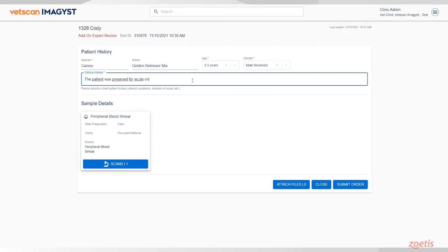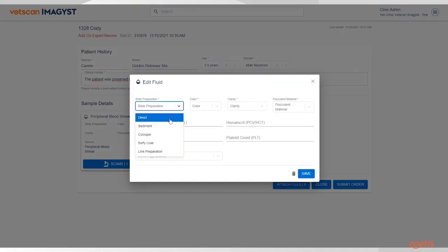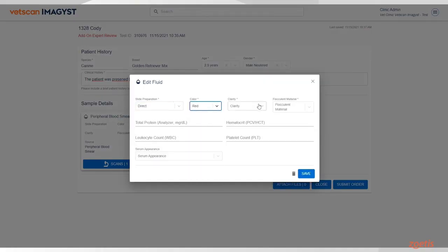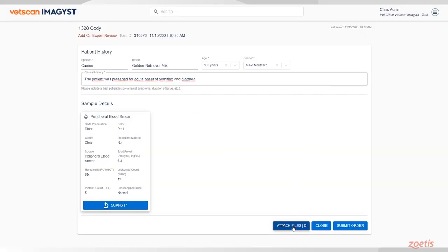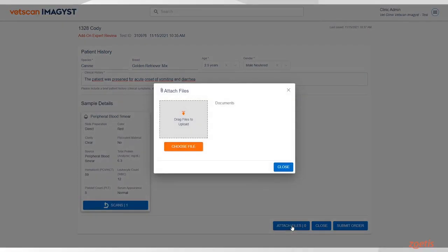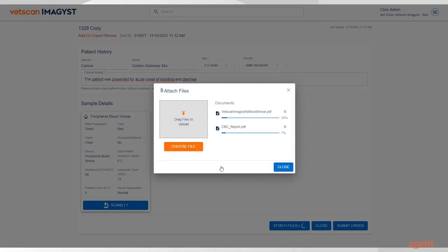Include a brief clinical history. Next, click on the pre-populated sample card to add additional information. You can attach additional files that the pathologist might find useful. Click Attach Files and upload any JPEG or PDF. We strongly recommend attaching the corresponding blood work, including the CBC and chemistry reports.